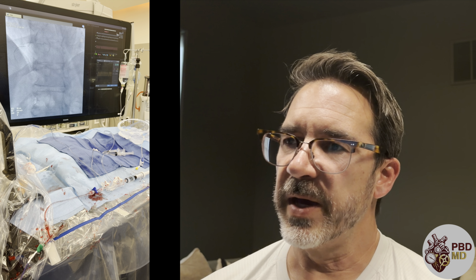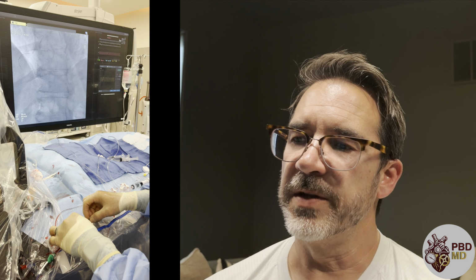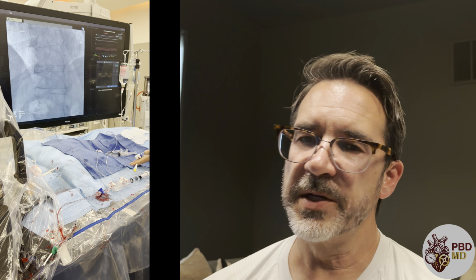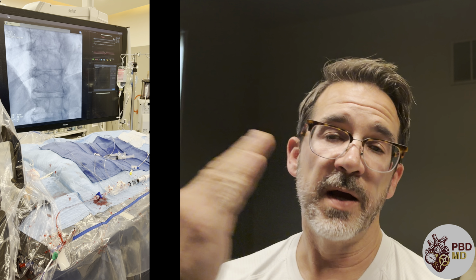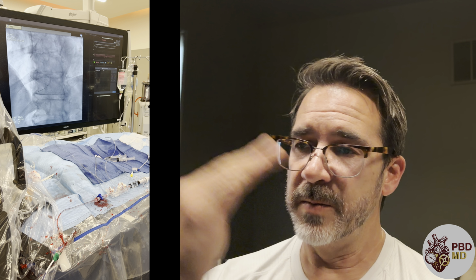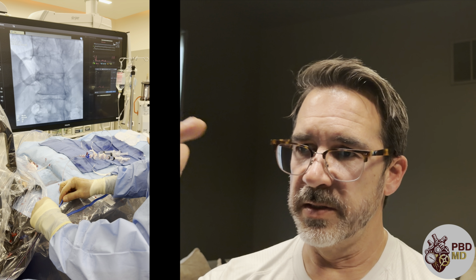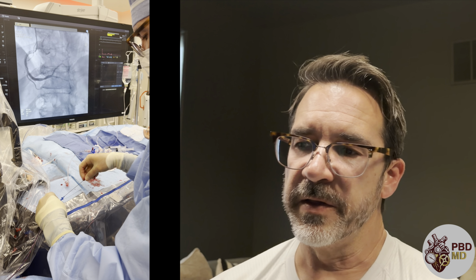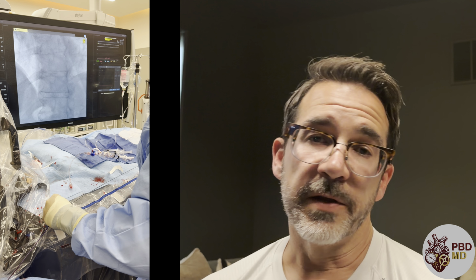And so what we do is we have what's called an FFR wire. This is a very clever tool. The wire itself has a pressure transducer, so we can measure the blood pressure downstream of a blockage in question and then upstream at the same time, and we compare them. We have metrics to say, downstream compared to upstream, is there a reduction in flow? And if there is, is it significant enough that we should be putting in a balloon or another stent?